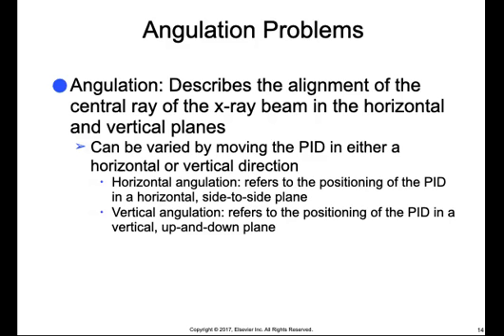Incorrect vertical angulations result in an image that is not the same length as the tooth, and the image will instead appear shorter or longer. Overlap contacts can be defined as the area where the contact of one tooth is superimposed over the contact of an adjacent tooth, and this type of error occurs with incorrect horizontal angulation.